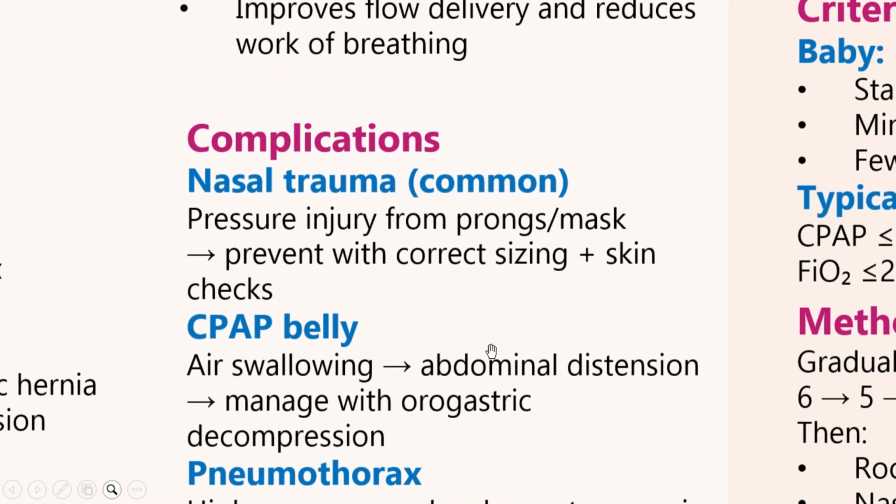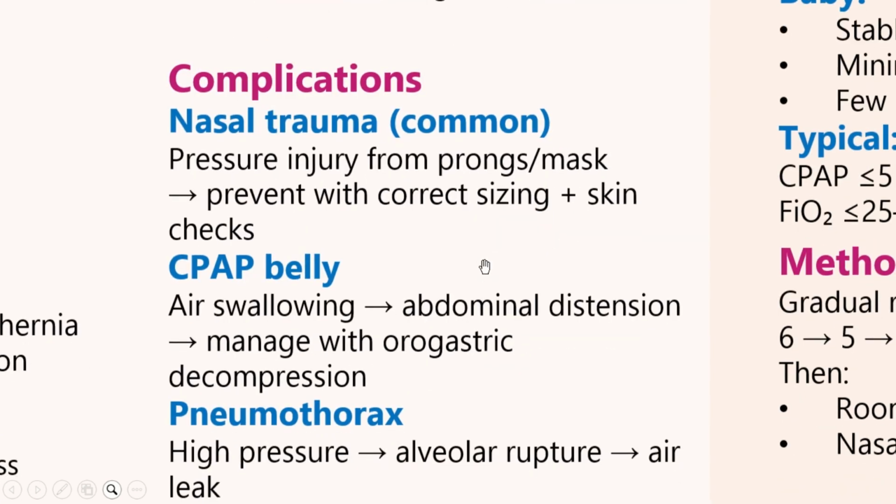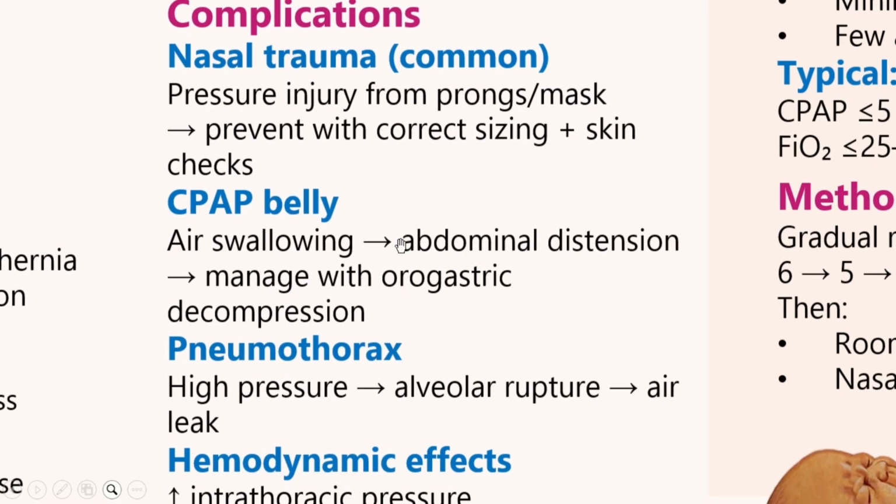So we have the complications of CPAP, and one of them is nasal trauma because of those prongs, and you have to make sure that you have the correct size of prongs and check the skin. Then we have CPAP belly due to air swallowing.